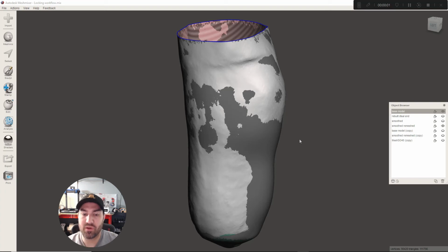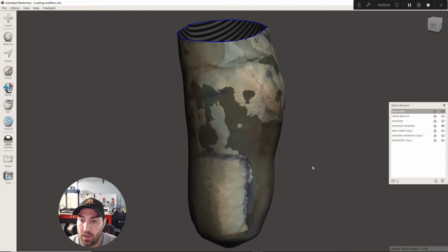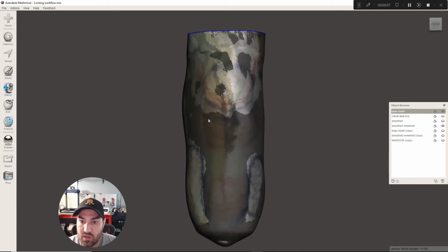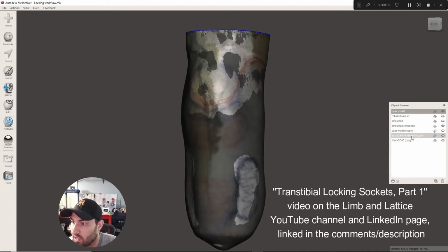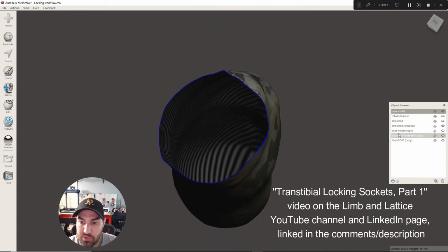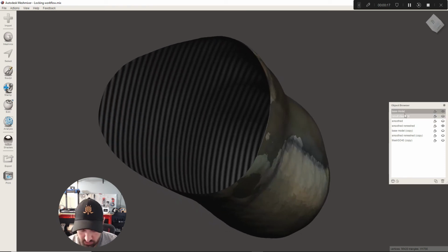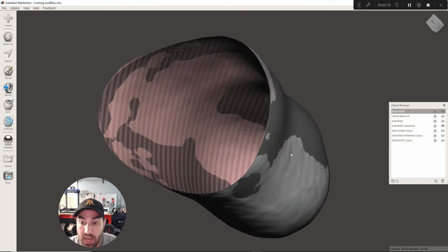Hey, good morning, everyone. I wanted to do a quick follow-up on yesterday's video about doing modifications on a transtibial limb and just show you a couple other things, because we have some new tools, the measurement tools we figured out recently, and I want to use those now to help guide my modifications.